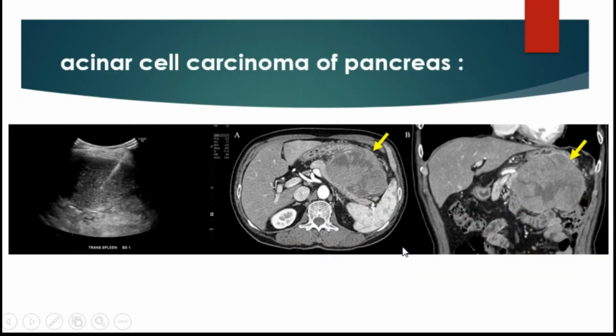Histopathology. And we have acinar cell carcinoma of the pancreas. So does this mean adenocarcinoma or neuroendocrine? It's adenocarcinoma. This is how they appear on ultrasound. What is this line? Needles, the biopsy. Yes, they are doing a biopsy for it.